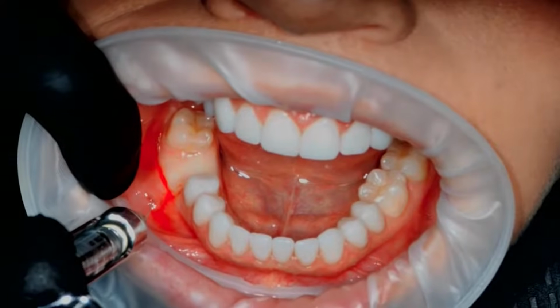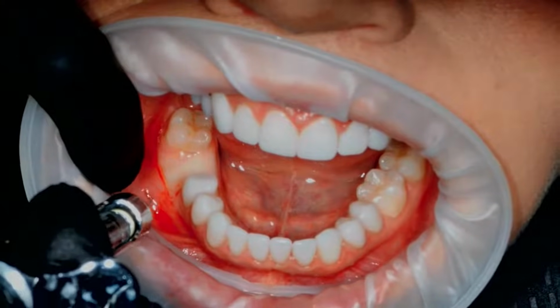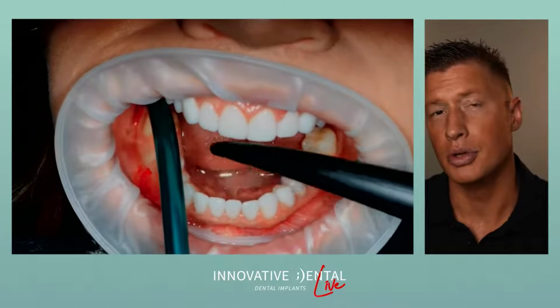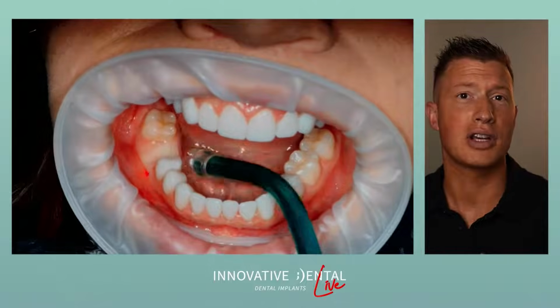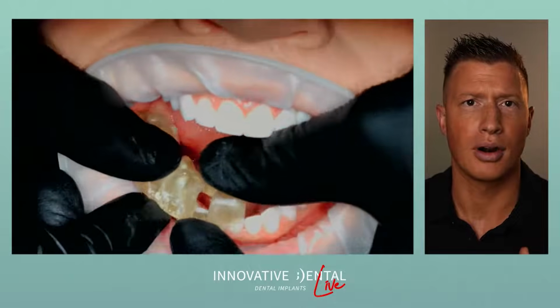That's another good thing to mention for dental implants. If you're going to have a tooth taken out and there's an infection present, that's the reason we didn't place the implant the same day we removed the tooth. If there's an infection present, we don't want to risk that infection messing up our implant success.